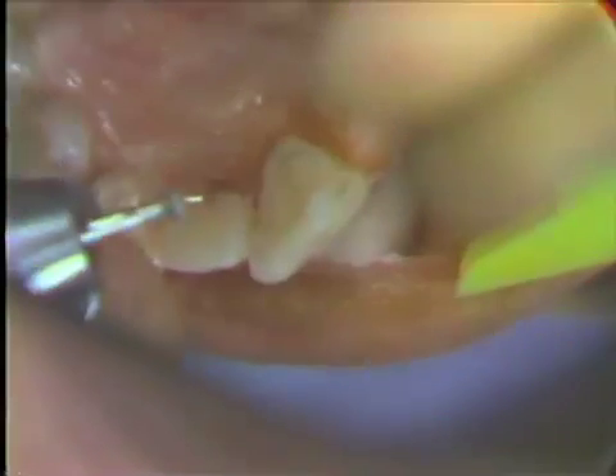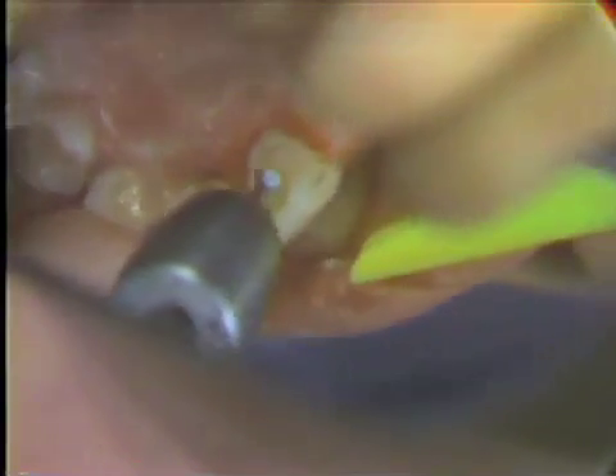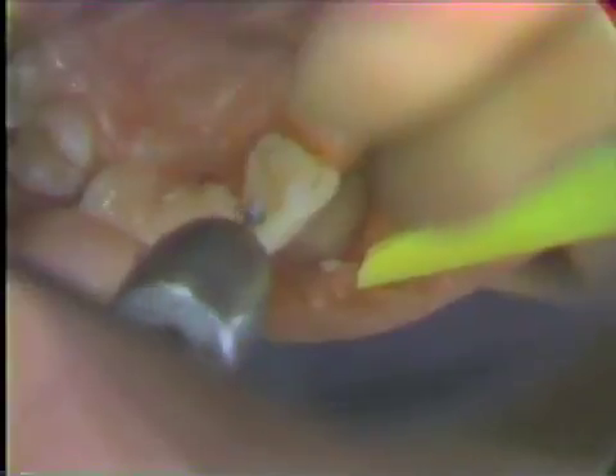Then you take the same diamond, turn it, and establish the inside of the ledge. You make this cut about a millimeter deep.